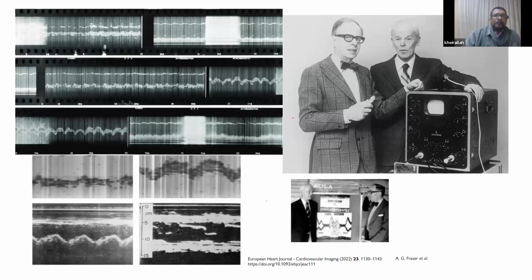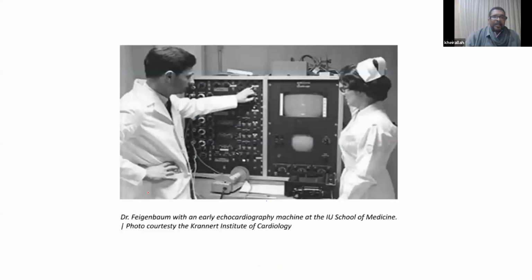In the 50s, Edler and Hertz, an alliance between a physician and a physicist, started to drive from warfare technology into medical technology. They started the first use of ultrasound in the study of the heart, and they got images like this.